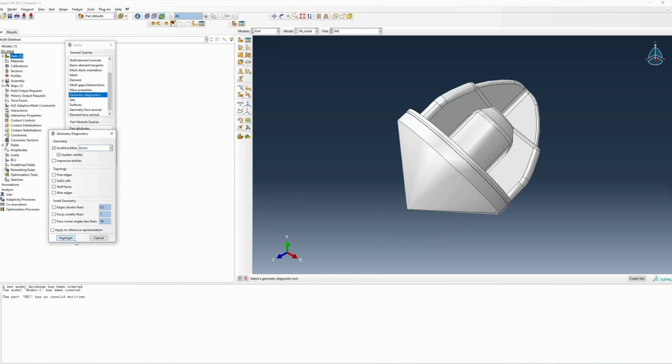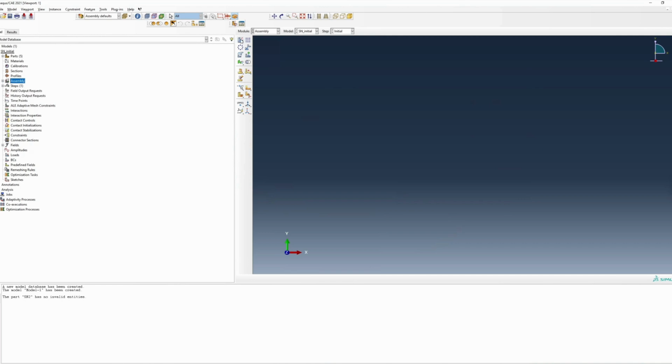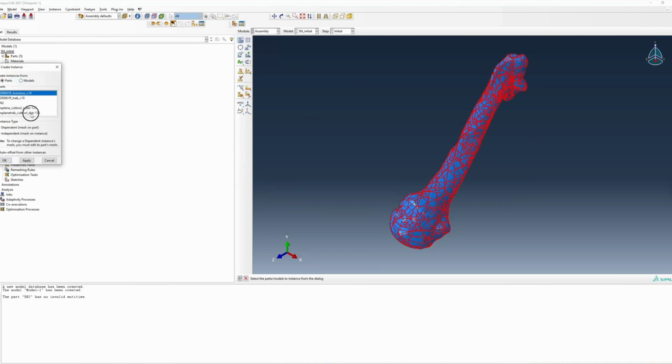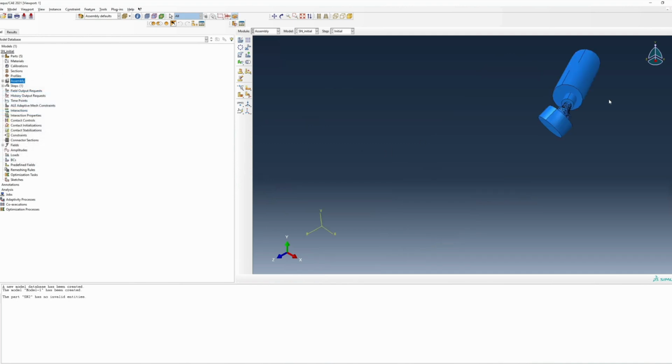Another good practice is to ensure that you do a geometry diagnostic query to ensure that your part contains no invalid entities. We'll be able to deal with imprecise entities, but invalid entities will be much more of a headache than it's worth. So I would probably suggest that instead of importing invalid entities, you go back to your design and you ensure that you have a fully enclosed, watertight volume or solid body without any imprecisions.